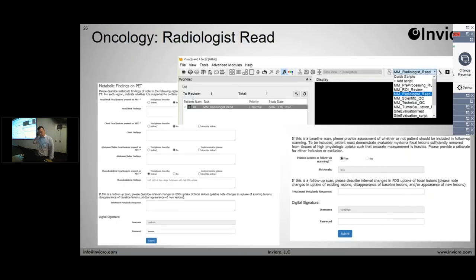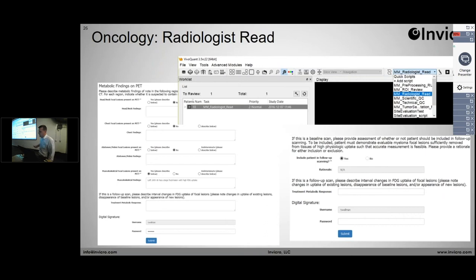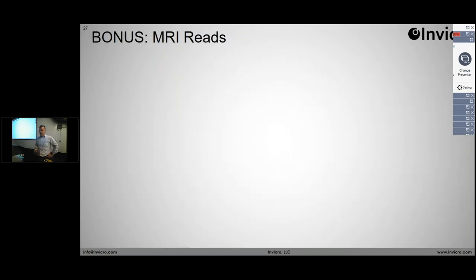Here are a couple of screenshots of what that can look like, where we have a series of VivoScripts driving this workflow, tied together with an IPACS-based workflow for navigating users through the steps. We can have segmentation where candidate regions are automatically identified and then an ROI review by a radiologist who can go through each lesion and either accept it as a focal lesion or reject it with some criteria. We're also using VivoQuant for radiologist read functionality, where radiologists can use electronic case report forms within VivoQuant to make a more traditional read that can be uploaded to the IPACS in collaboration with that quantitative data.